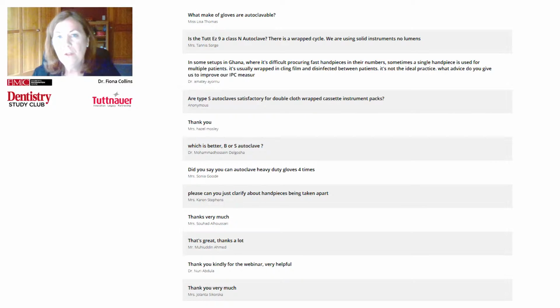Okay, hi Fiona, what was the name of the glass vial bottles with the dye that changes colour specifically for ultrasonic cleaning testing? The dye bottles that I showed are actually from Tuttnauer, and that's the ones that go from blue to yellow. So I would inquire with them if they're available in your area.